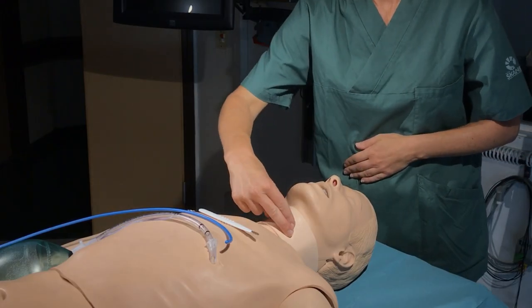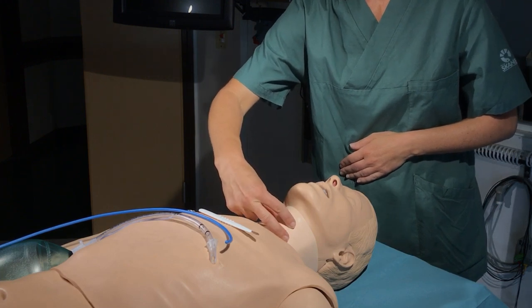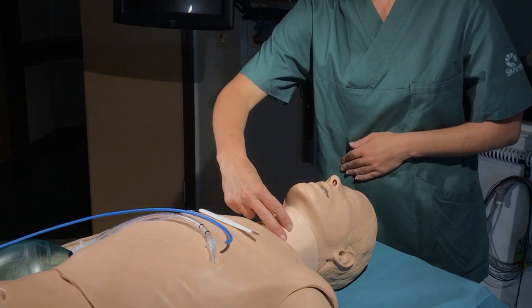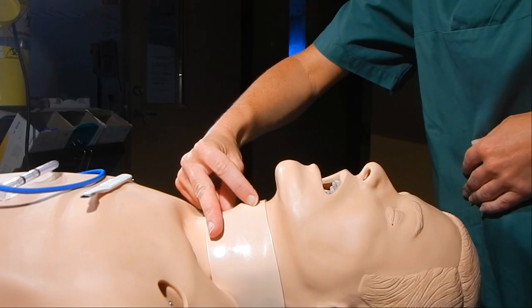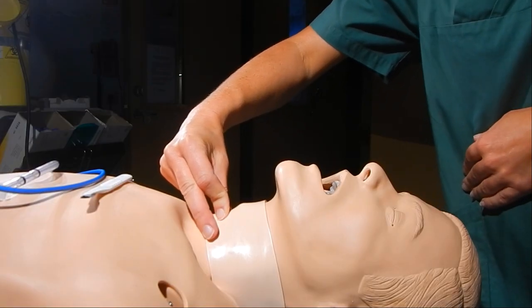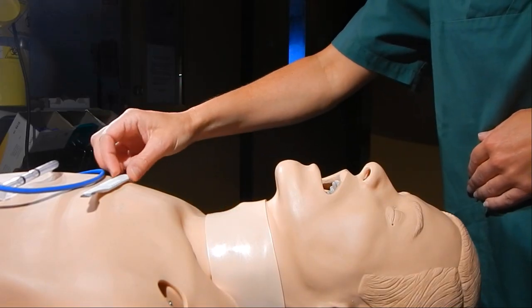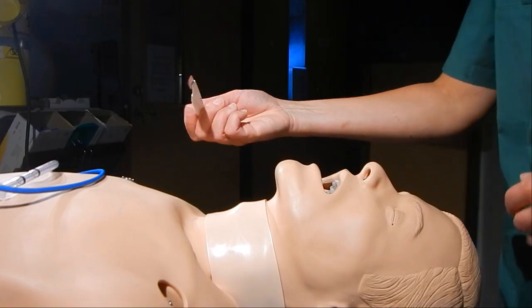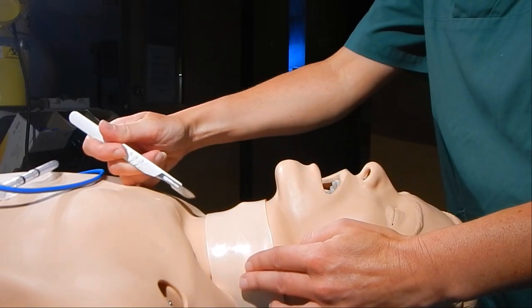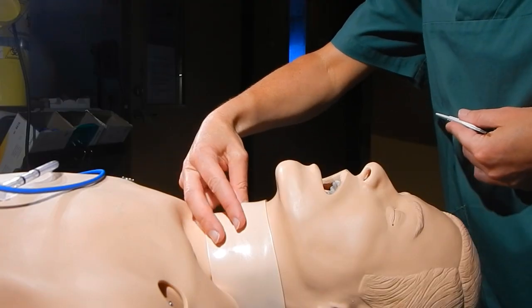To perform the technique, do the laryngeal handshake. You have to find the larynx and feel the cartilage under your fingers. Feel down the midline with the finger and identify the thyroid and cricoid cartilage and the cricothyroid membrane. If you can't feel the cartilage clearly at this stage — for example in a patient with a fat neck — make a vertical incision and dissect bluntly with your fingers until you feel the structures.